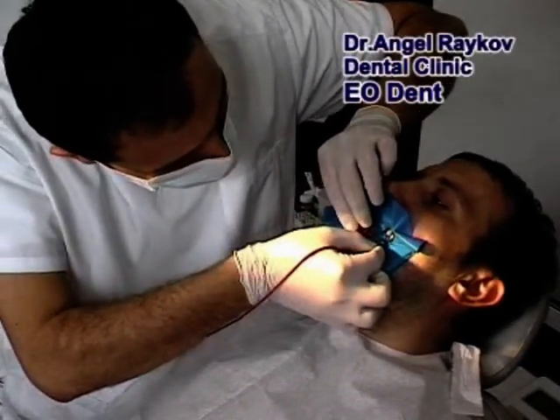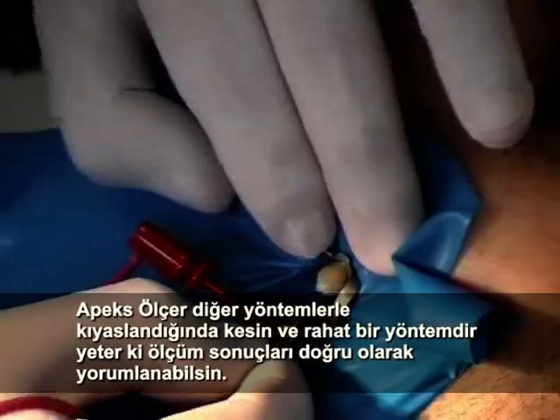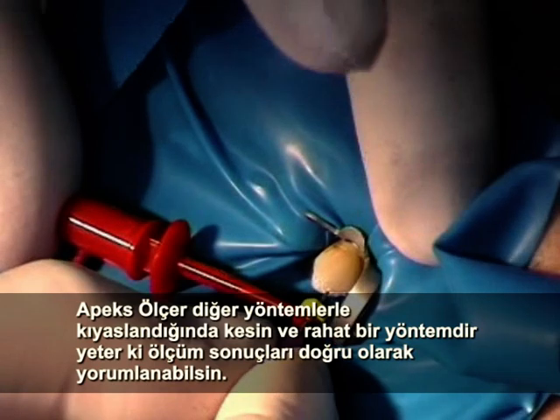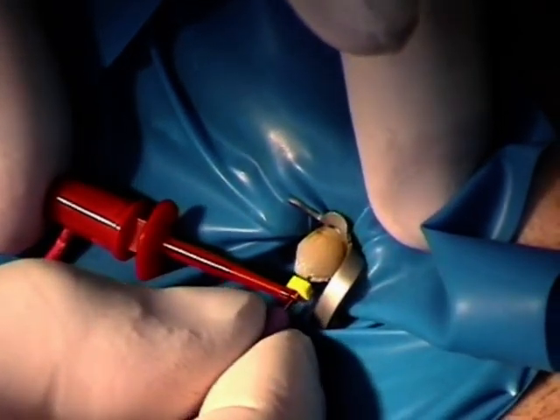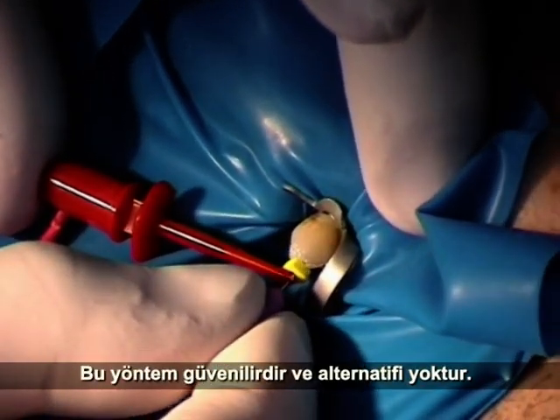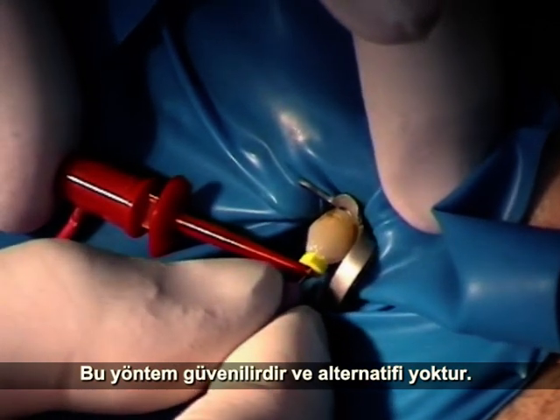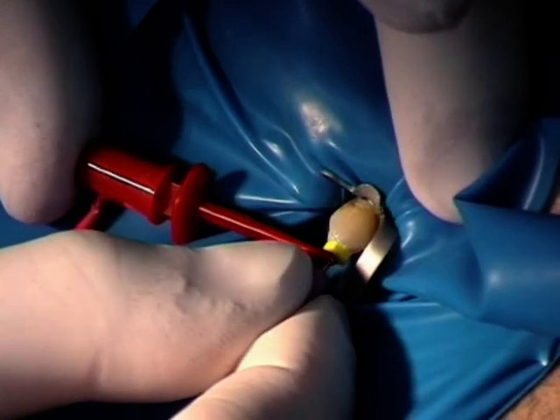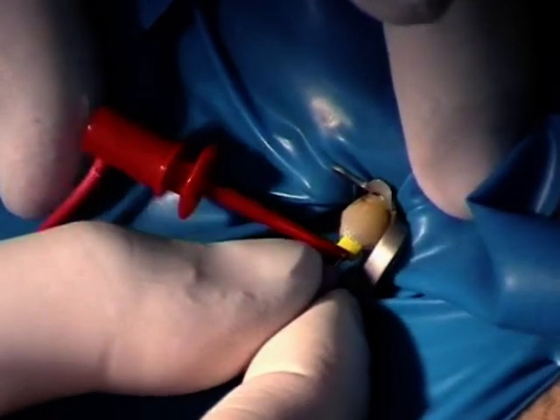Apex location is a comparatively exact and convenient method for work if the results of measurement are interpreted correctly. The method is reliable and at present has no alternative.